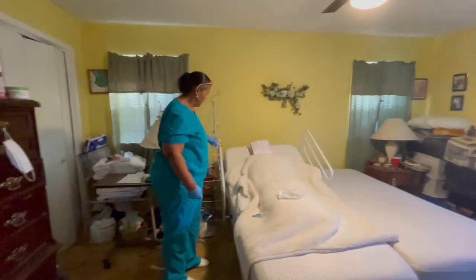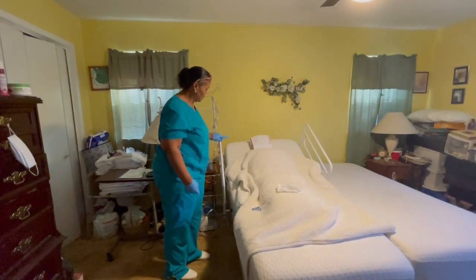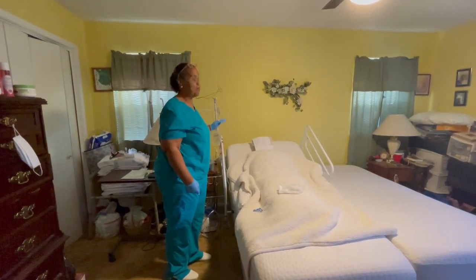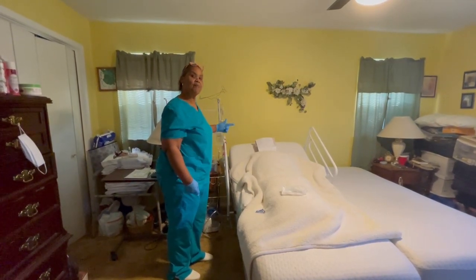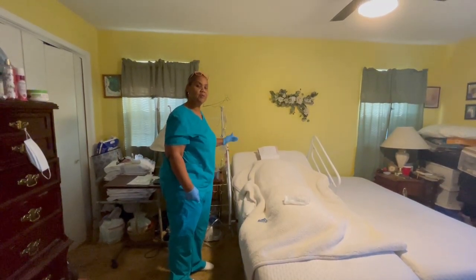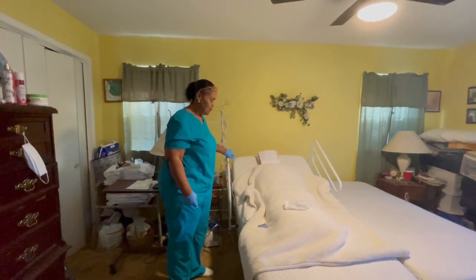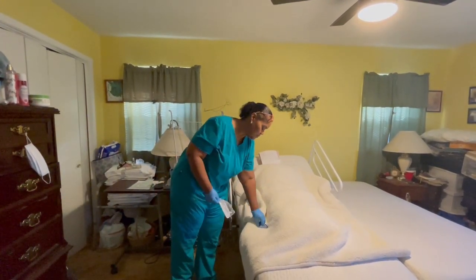So once I've done my pump, I'm going to open up my clamp. I'm not sure if I told you this either, so I apologize if I didn't. On the pump, it's going to already be set on the primary rate. So I want to stop it and flip it over to the secondary rate, okay? And that's when you're going to put in your volume and your time. Once you've done that and everything is correct, you're going to open up your clamp. You're going to start your IV. You're going to make sure that everything is going fine. That's going to run for about 30 minutes.